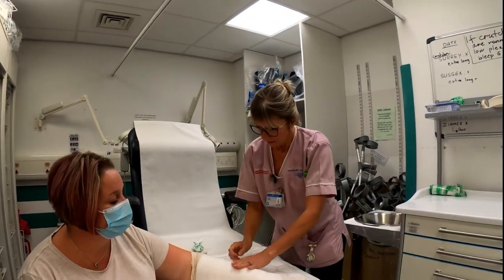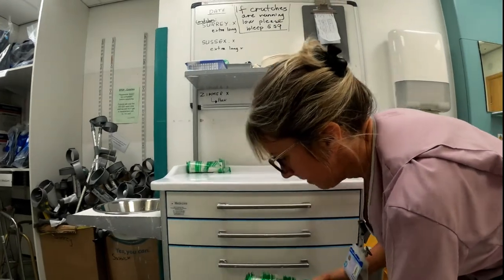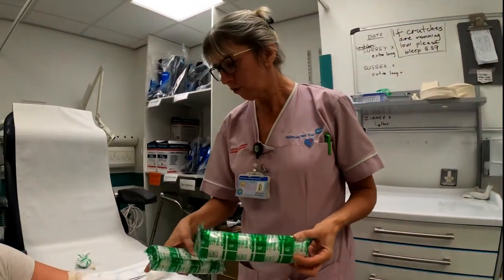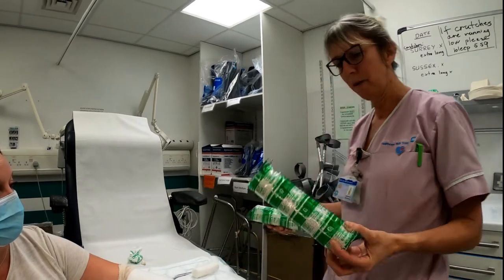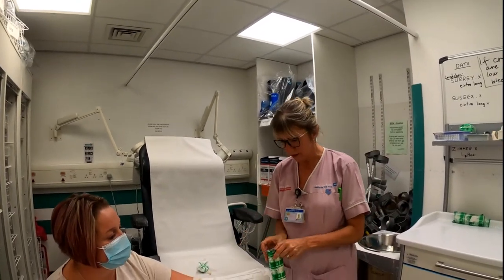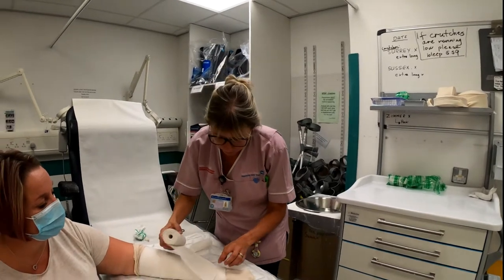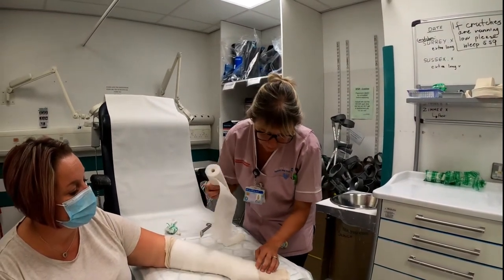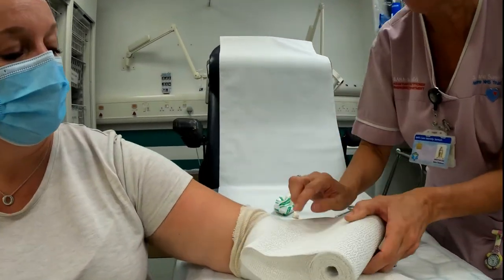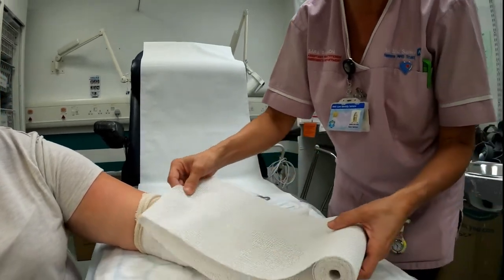Now we're ready for the plaster. Check your size — this is the widest, 20 centimetres, and that is a 15. For Sarah here, to ensure two-thirds coverage of the limb, we'll use the 20. The back slab just goes on the back but tucks around the radius and the ulna, so if you have either a fracture of the radius or ulna, both are covered. Bring it a little bit short of your soft band by one to two centimetres on each end so that when we fold everything back it won't get too close to the elbow crease.